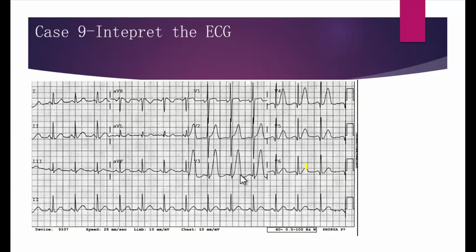Looking at the ECG, there are T waves that are symmetric, especially looking at V3, V4, V5, and V6, and they are broad at the base, and they are not as pointy, so they are a little bit flatter at the edge. So I was thinking this could be serious because of myocardial ischemia.